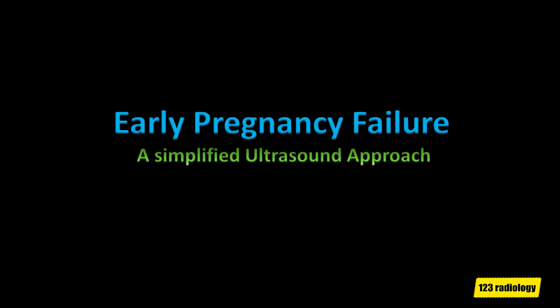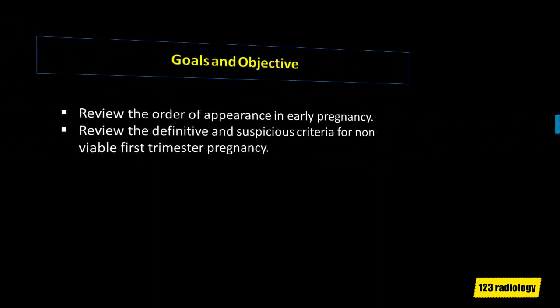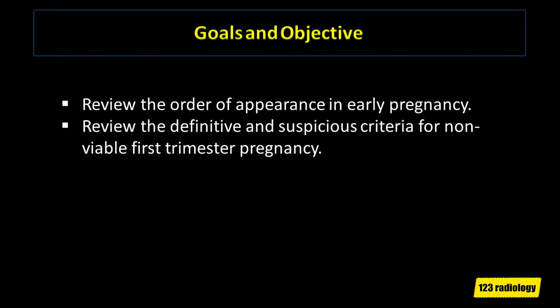Welcome to this lecture about early pregnancy failure, a simplified ultrasound approach. The goals and objectives of this talk are to review the order of appearance in early pregnancy and to review the definitive and suspicious criteria for non-viable first trimester pregnancy.